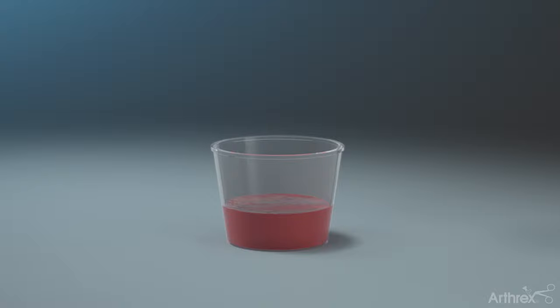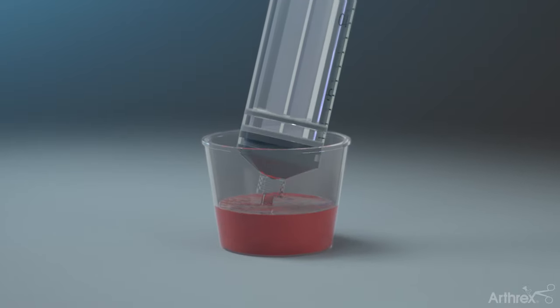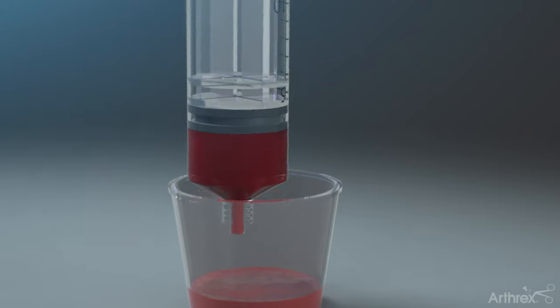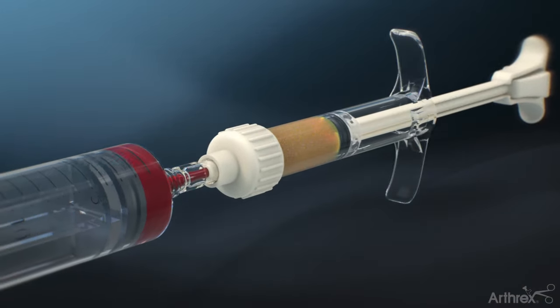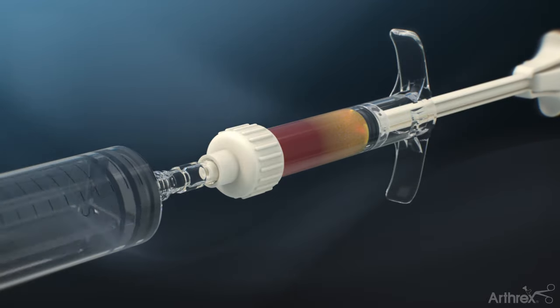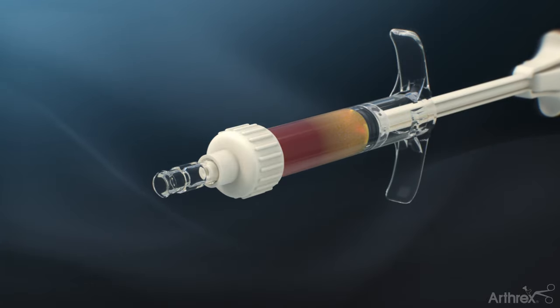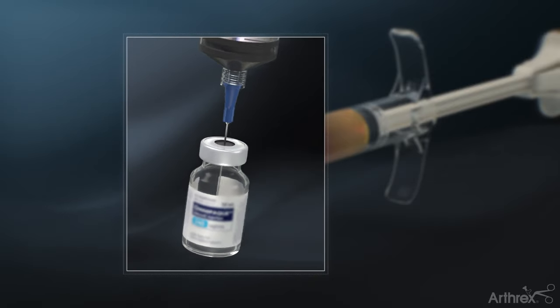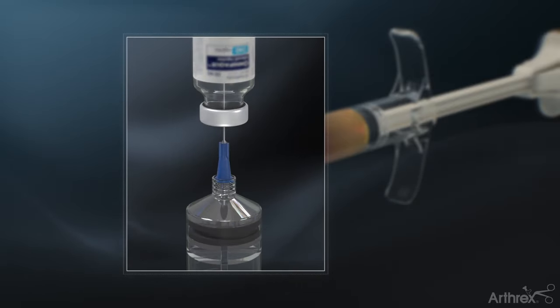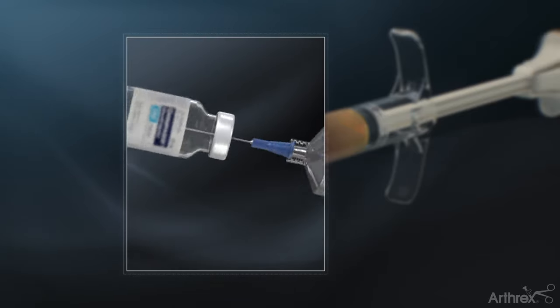To prepare the biologic graft to backfill the decompression site, the BMA is transferred into a separate sterile basin and drawn into a syringe. The BMA is transferred to the mixing and delivery syringe filled with AlloSync Pure using a female-to-female luer adapter. Optionally, contrast may be utilized to aid in visualization of the graft during backfill of the core decompression site.